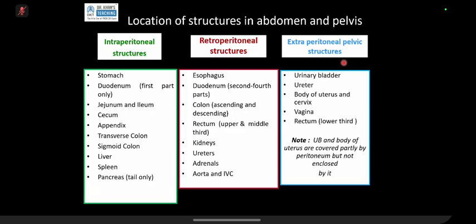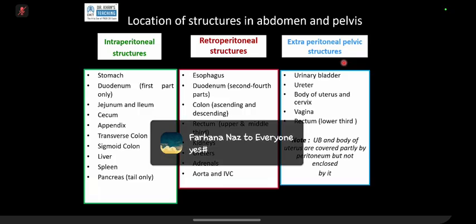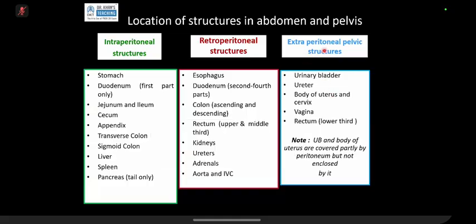Bladder rupture, extraperitoneal bladder rupture versus intraperitoneal. I am sure you must have read about it. That bladder rupture can be intraperitoneal, bladder rupture can be extraperitoneal. Okay, so what happens is that this space is where we are concentrating.